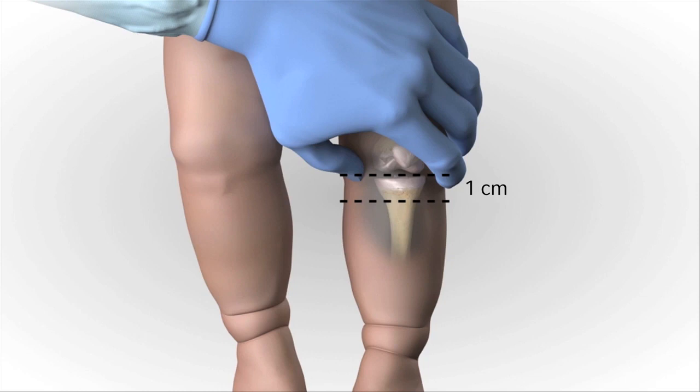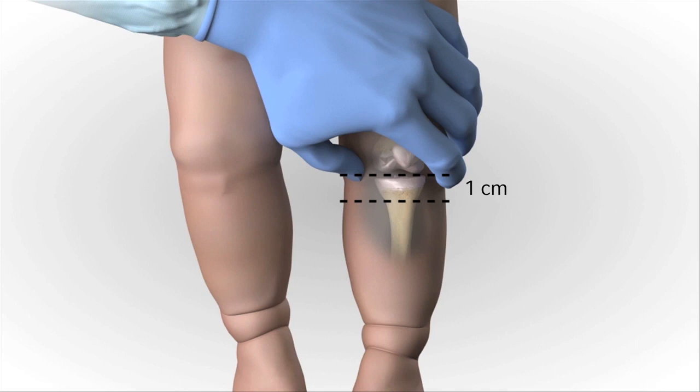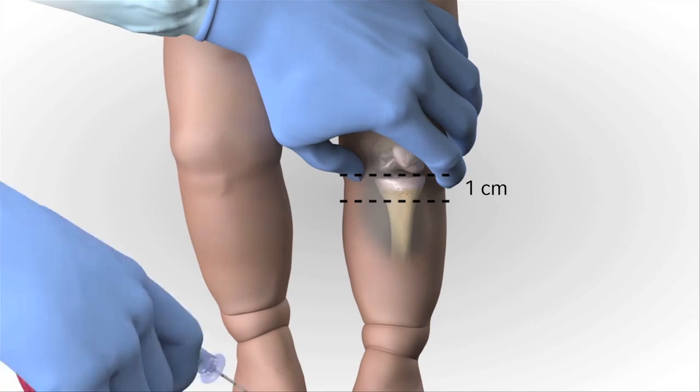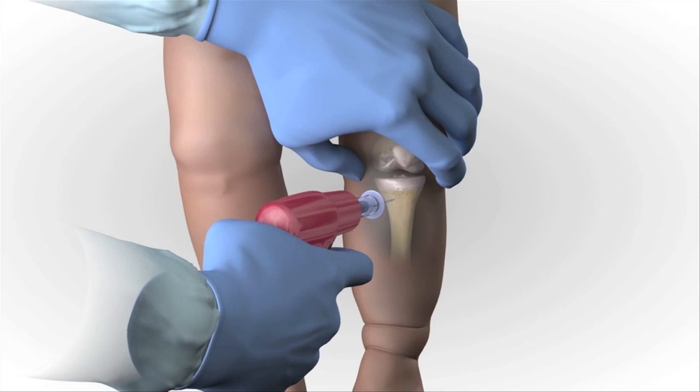The insertion site is approximately 1 cm along the flat aspect of the tibia. Pinch the tibia between your fingers to identify the center of the medial and lateral borders. Remove the needle set cap. Stabilize the extremity and aim the needle set at a 90 degree angle to the center of the bone.